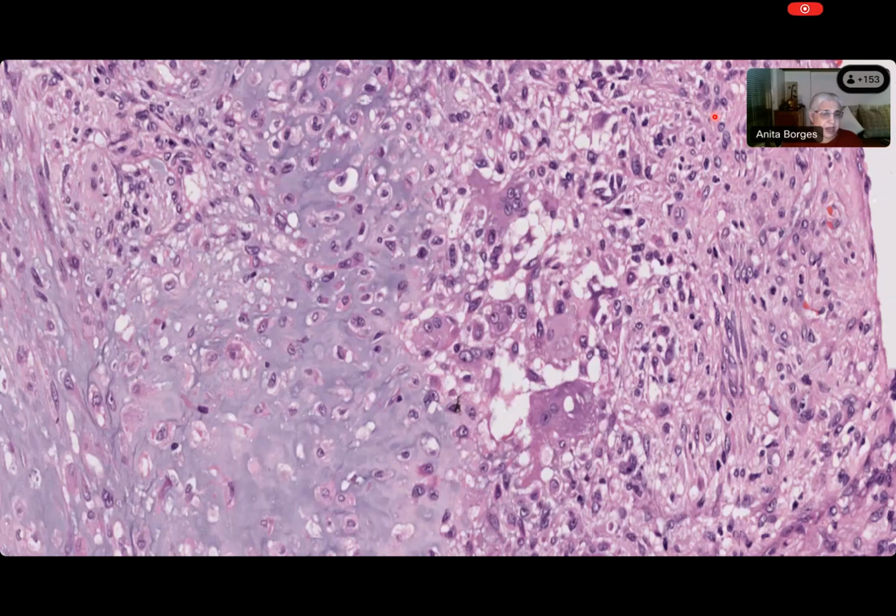And it is made up of what? What is normal hyaline cartilage like, Sarangi? You saw it in the last case that we discussed. It has chondrocytes which are all the same, and they have almost pyknotic-like nuclei. Look at this. There is variation in size, shape, nuclear density, everything. Now you tell me, how can this be normal articular cartilage?